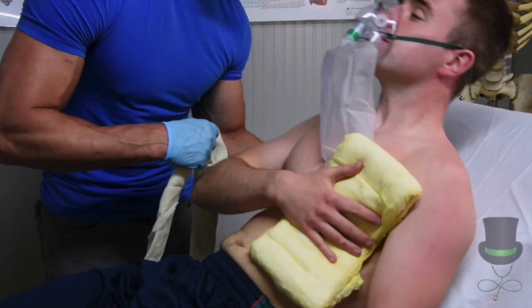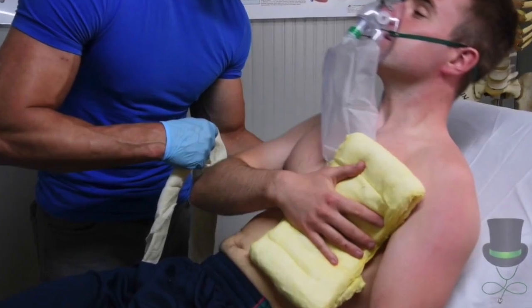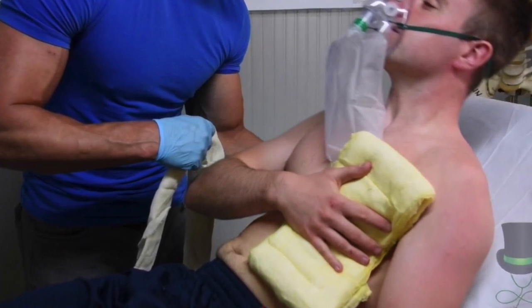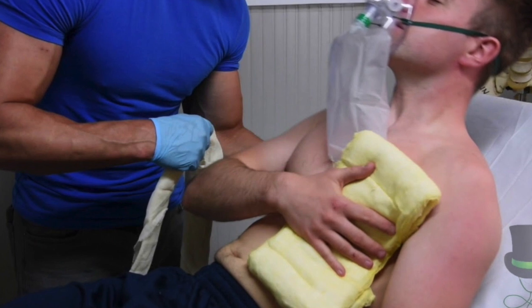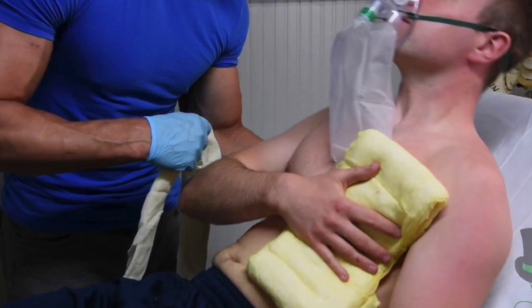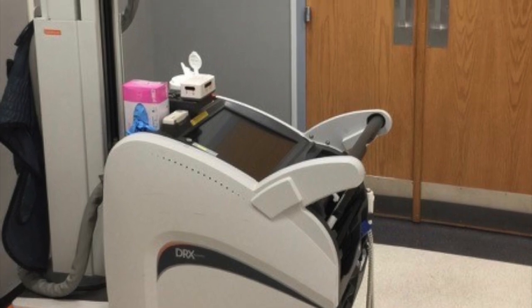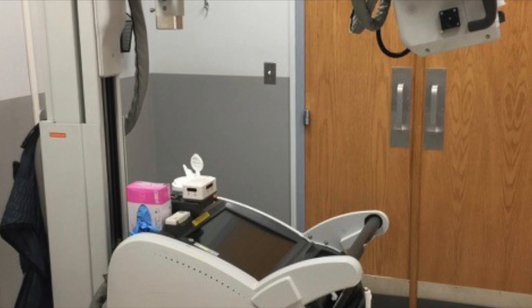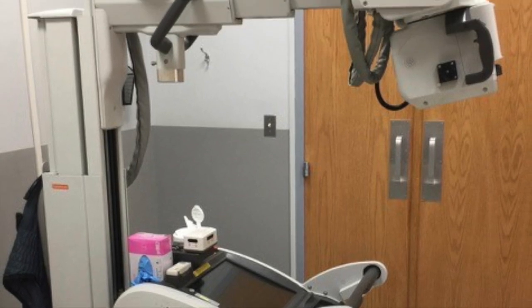In this case study, a 45-year-old male backseat passenger was involved in a high-speed motor car accident during the middle of the night and crashed into another vehicle. He was immediately rushed to the hospital and was assessed by the attending physician. A portable chest X-ray was ordered for this patient to be able to rule out any fractures and any other injuries.